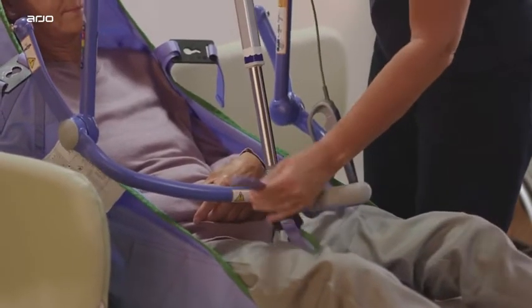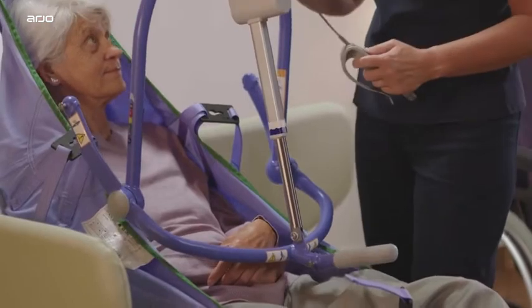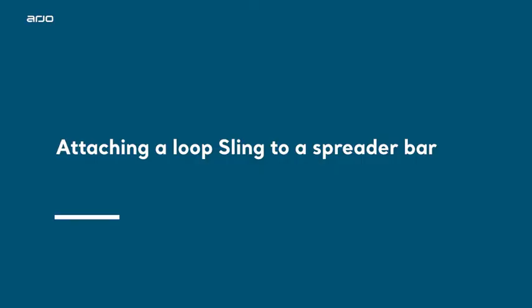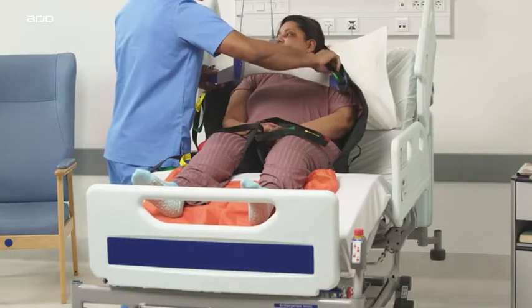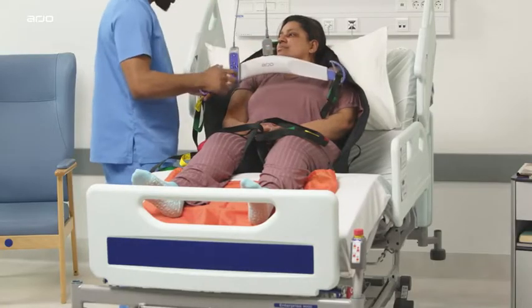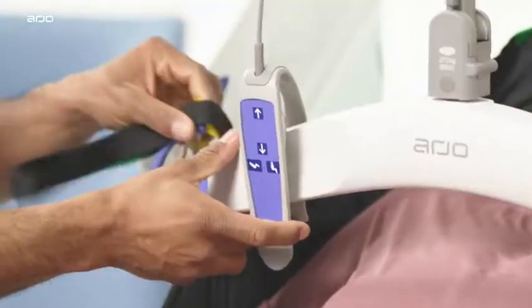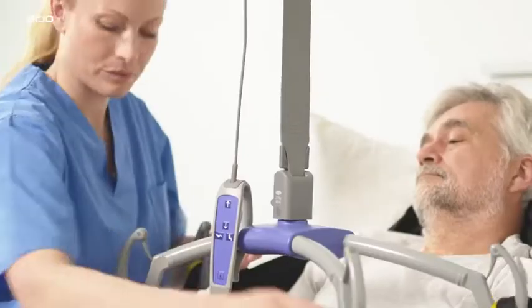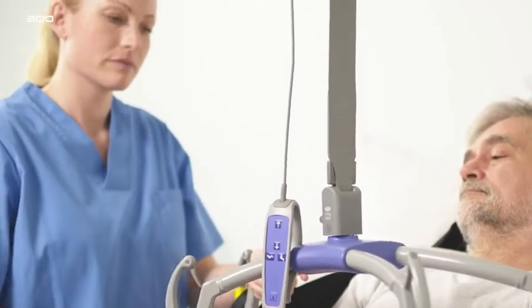Pull the sling up to release the lock. Remove the clip attachment from the lug on the PDPS. Attaching a loop sling to a spreader bar. Place the attachment loop onto the hook. Make sure the loop is positioned correctly and that the safety latch is closed over the hook. Repeat the same procedure for all loops.